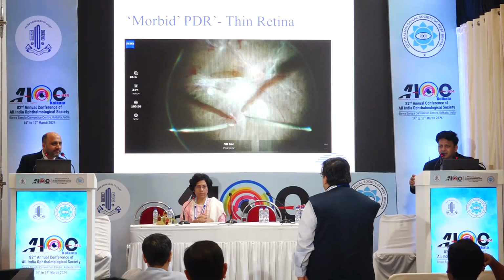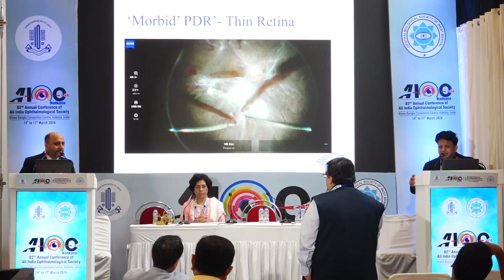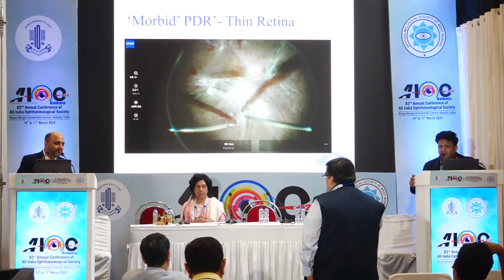I will not touch a disc which is looking visibly vascular. Like this particular disc does not look that vascular. I would have probably started off at the disc. If it's looking too vascular, then one can avoid touching it.